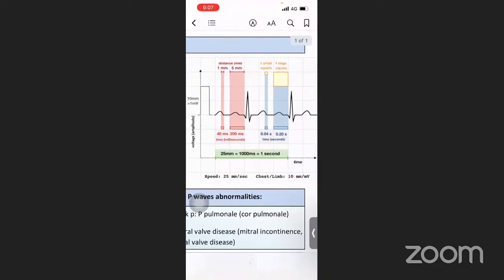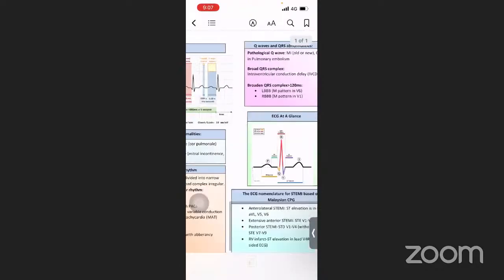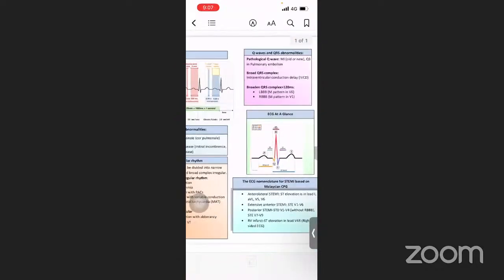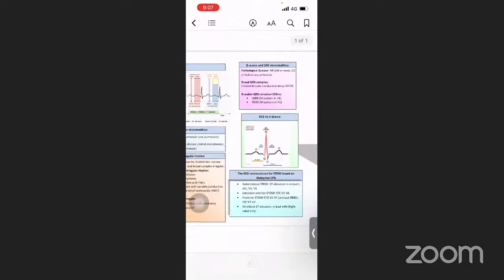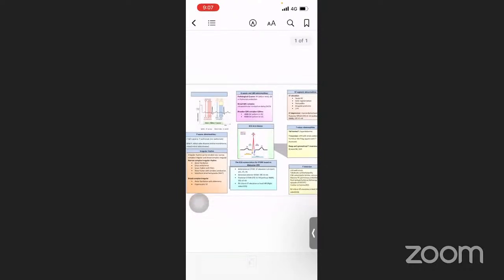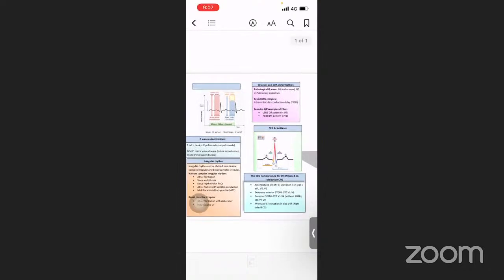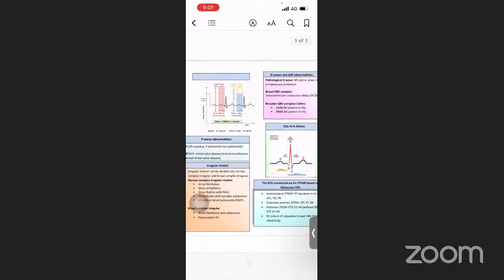Now we are going to talk about what are the normal rhythms followed by the abnormal rhythms. Normal, in the sense, it has to be normal heart rate, so the first step is heart rate, plus normal morphology. An abnormal ECG, you can further categorize in 2 ways.